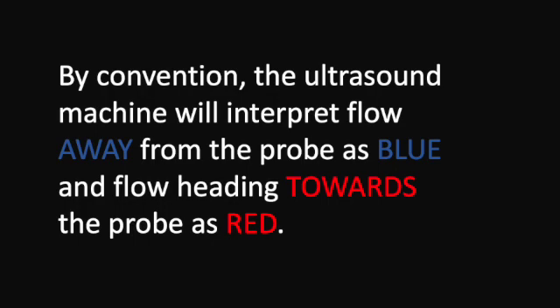So here's a key slide. By convention, the ultrasound machine will always interpret flow away from the probe as being blue and flow heading towards the probe as being red. There's an acronym for this. You can remember either TRAB or BART. I like BART personally. And this is a key point.